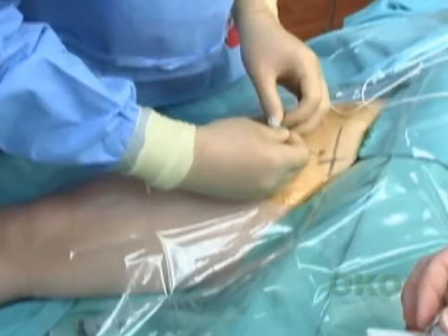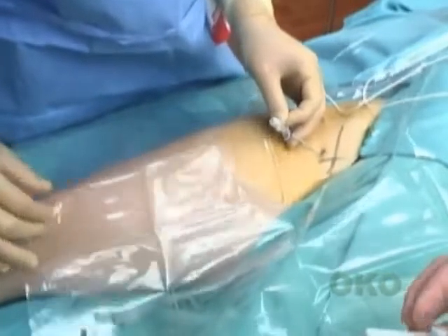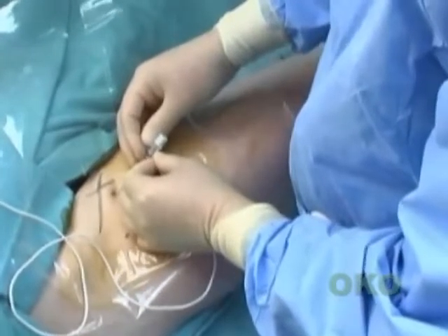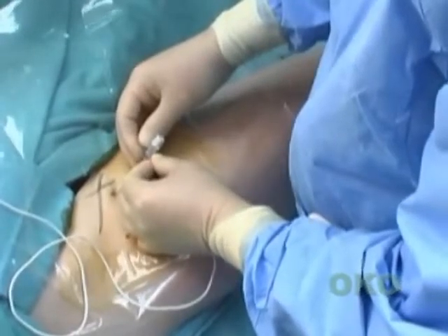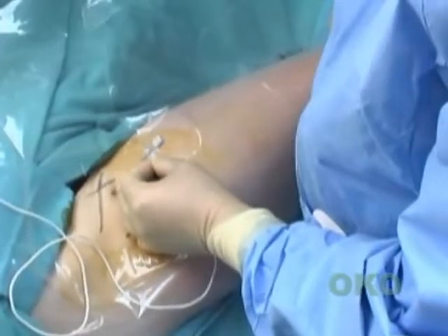The bevel of the needle points upward, and the needle enters at a cephalad angle of approximately 45 degrees. Notice the 2 pops as the fascia lata and iliaca fascia are penetrated, and notice the cephalad movement of the patella as the femoral nerve is stimulated. The nerve stimulator output is turned down to between 0.3 and 0.5 milliamps, and a brisk motor response of the quadriceps muscle should still be present.